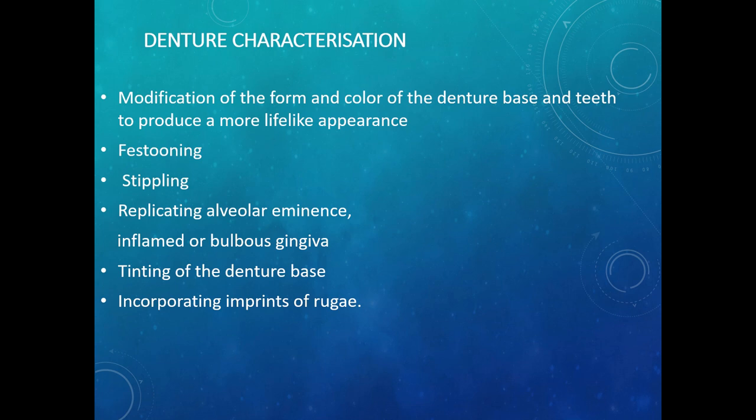Finally, coming to denture characterization. So characterization of a complete denture is necessary for the denture to have a lifelike appearance. And we have already discussed the benefits of a properly contoured denture base and also the indications of an aesthetic complete denture in our previous session.